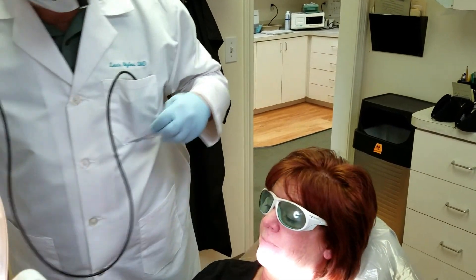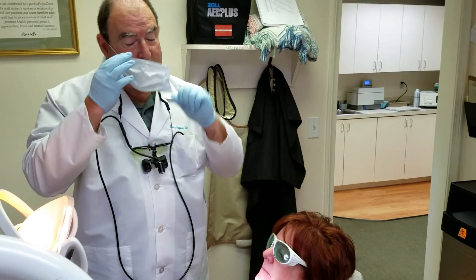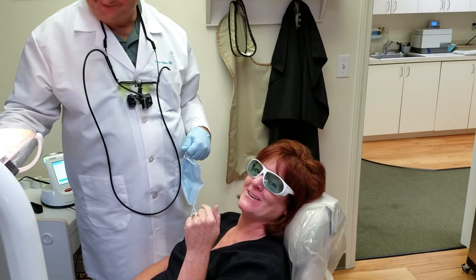How does that feel? Feels better. Great. That's all it is — nice and easy. When you get a canker sore, call Dr. Stylos.